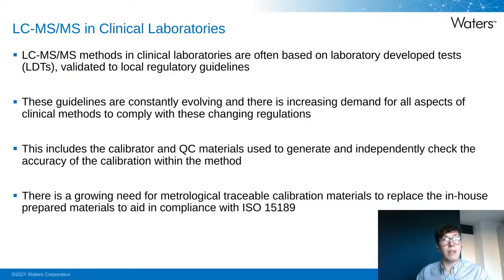So LC-MS methods in clinical laboratories are often based on laboratory developed tests or LDTs, and these are generally validated to local regulatory guidelines. So these guidelines are constantly evolving, and there is an increasing demand for all aspects of clinical methods to comply with these changing regulations. This includes the calibrator and QC materials used to generate and independently check the accuracy of the calibration within the method. So there is a growing need for metrological traceable calibration materials to replace in-house prepared materials in order to aid compliance with these guidelines, such as ISO 15189.